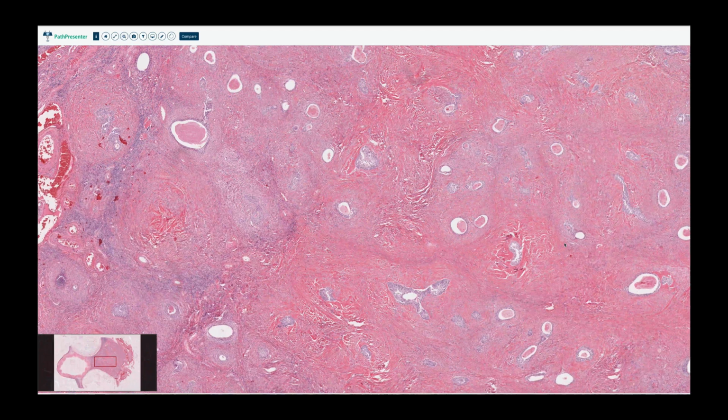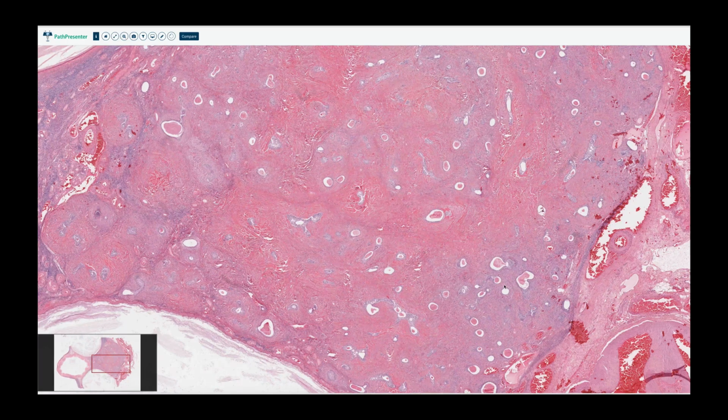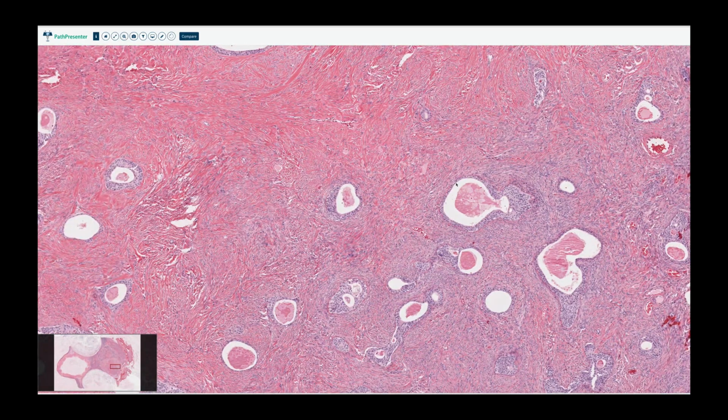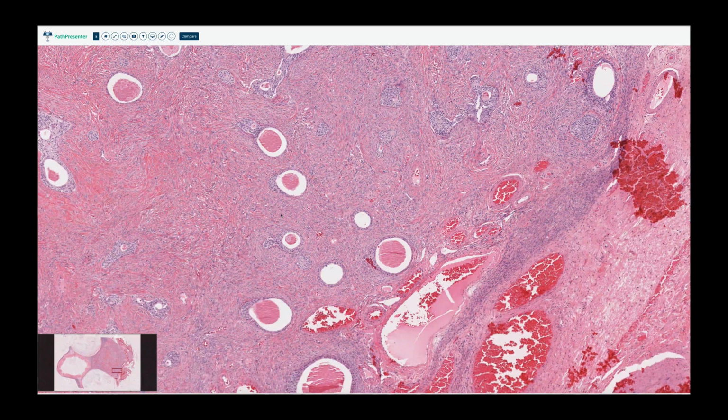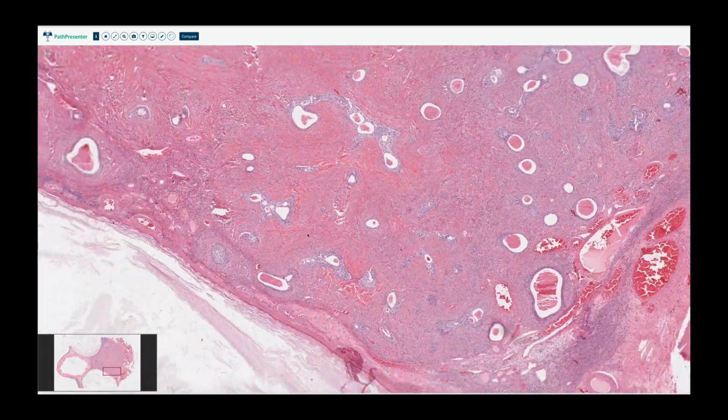Brenner tumors are usually firm. The differential diagnosis when you cut into one is that it'll look almost like a leiomyoma. They're so firm and so hard, or a fibroma. And then when you see the microscopic view, you see these transitional type nests. They're usually irregularly shaped, kind of diving through this hyalinized stroma. And sometimes you'll see mucinous cysts or metaplasia associated along with it.